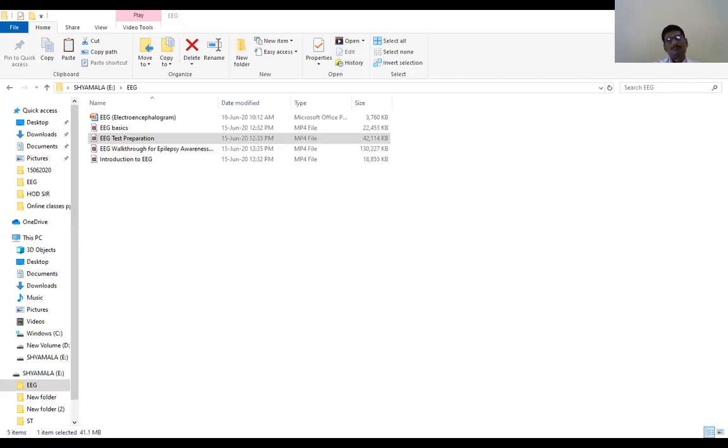Your doctor may order a routine EEG or a multi-hour or longer EEG. For the routine EEG, you will be allotted 90 minutes for the appointment, and this will include the electrode application process, the actual running of the test, which is 20 to 25 minutes, along with the cleanup process. For the multi-hour test, you will be allotted 3 hours, and the only difference is that the EEG will run for 75 minutes. Sleep is especially important in this recording since we have an extended time to record the data.